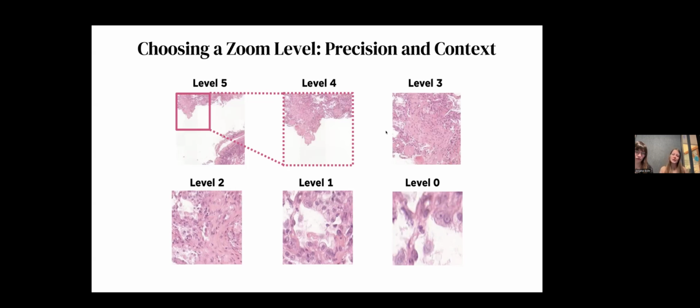So what we did is we took the statistics of the training datasets and computed the average bounding box of the training datasets and determined that it was similar to the size of the level 2 zoom. So we took the level 2 zoom, which was appropriate for the details, as well as the level 3 zoom, which gave a bit more context for our future approach.